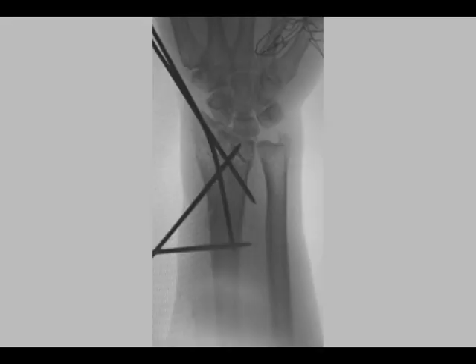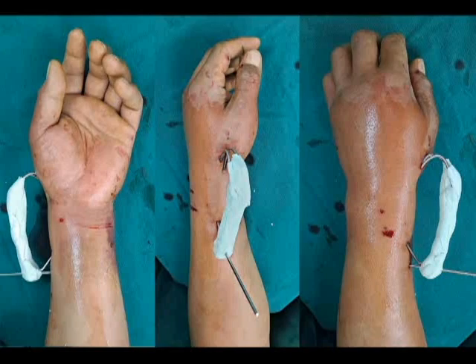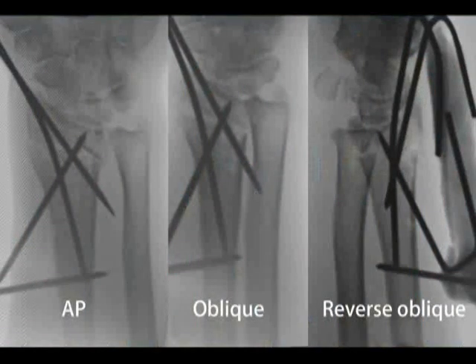Finally, we insert a fourth 2.5 mm K-wire transversely into the proximal fragment of the radius to prevent postoperative radial and ulnar translation and the rotation of the distal fragment. We bend all wire ends toward the fracture side and mount bone cement to secure all wire ends together. That cemented K-wire frame is created to maintain the reduction, the radius height, and prevent wire migration.